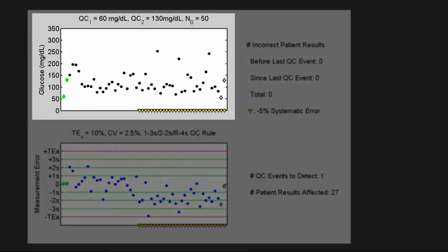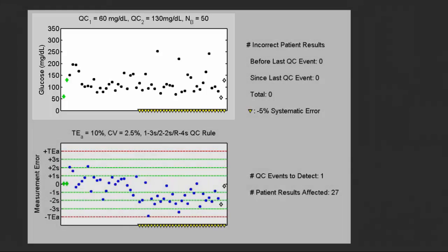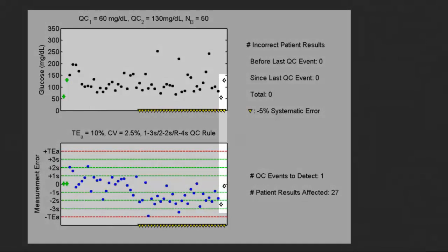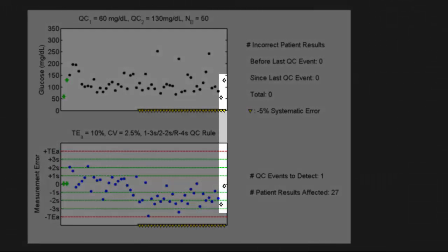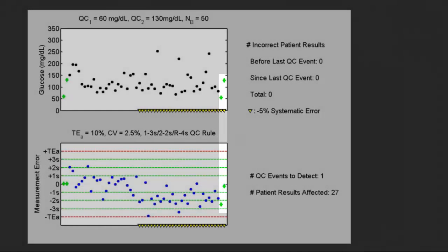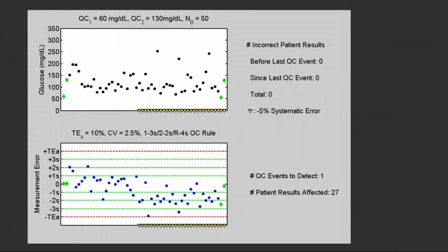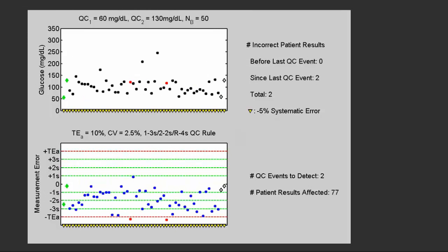However, if we look at the actual glucose results, it's not at all apparent that a shift has occurred. Here we see our next two QC's: one is between two and three SDs below its target and the other is almost at its target. So the QC rule isn't going to be violated. Therefore we continue to produce results that are adversely affected by this out-of-control condition.